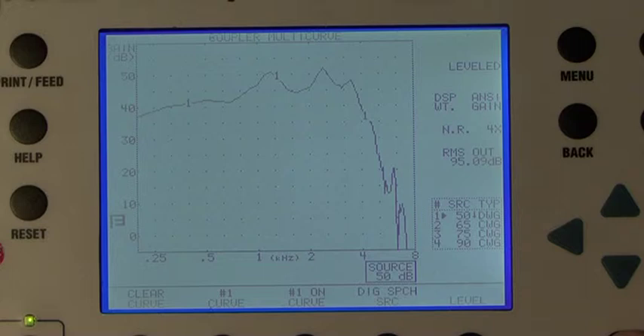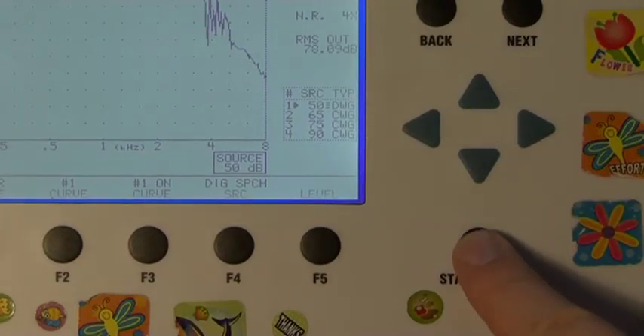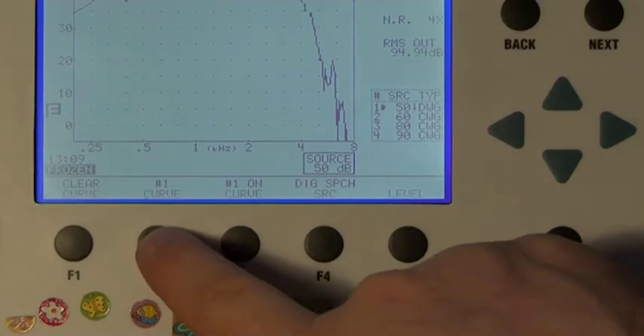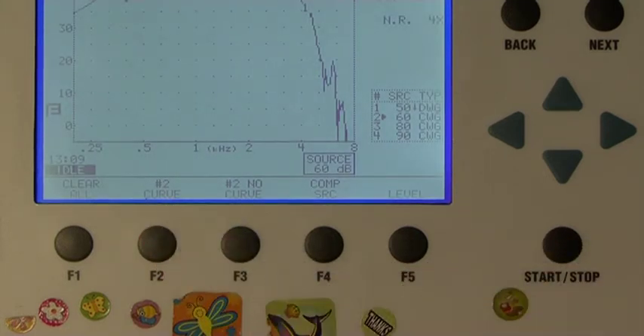Please note, the first response at 50 dB is particularly sensitive to external noise. You may also notice some hearing aids can be programmed to have quite a long start-up delay of up to 20 seconds before displaying a response on the screen. Press the Start-Stop button to freeze the curve. To create the second curve, press the F2 button so that on the screen it reads Curve 2.